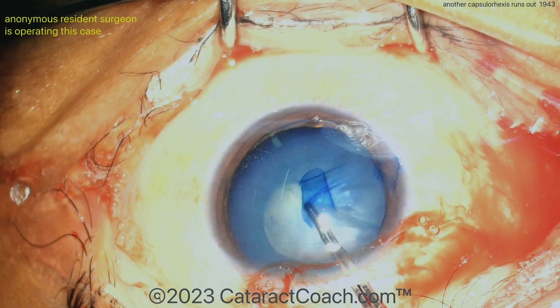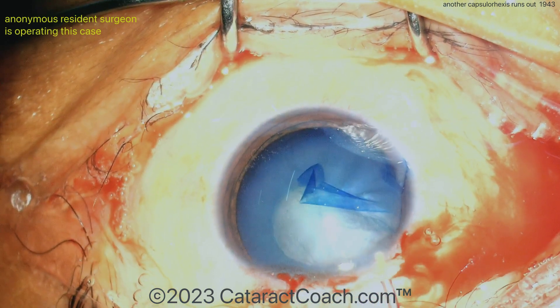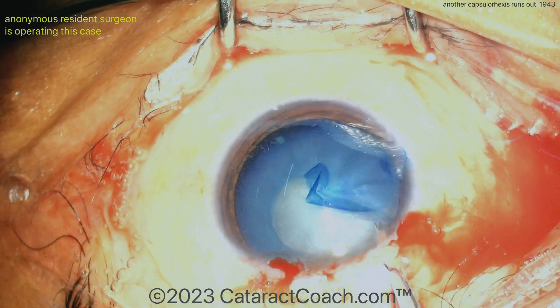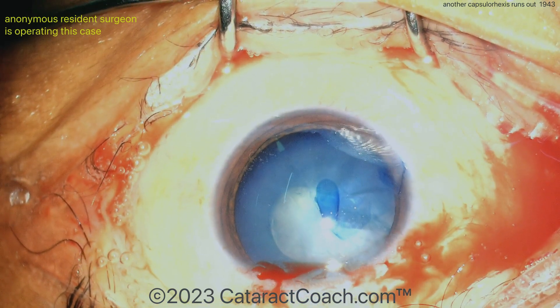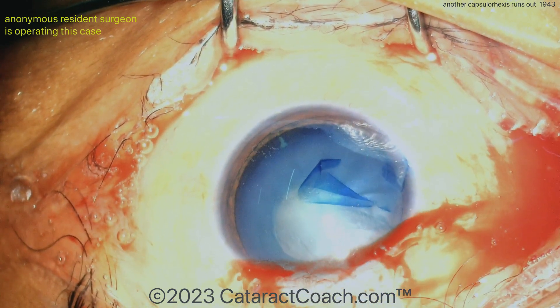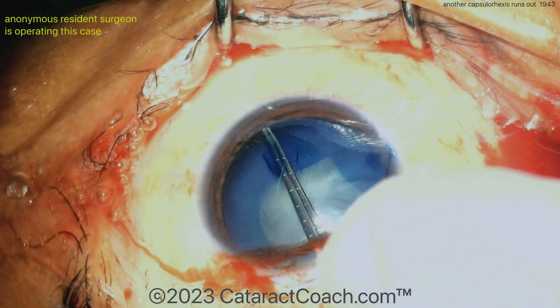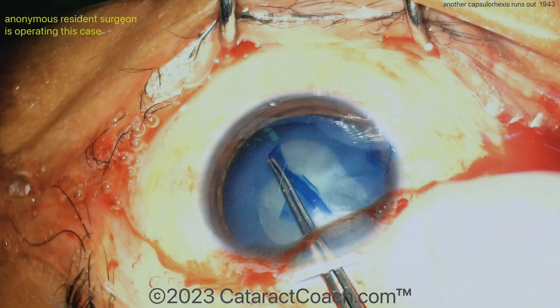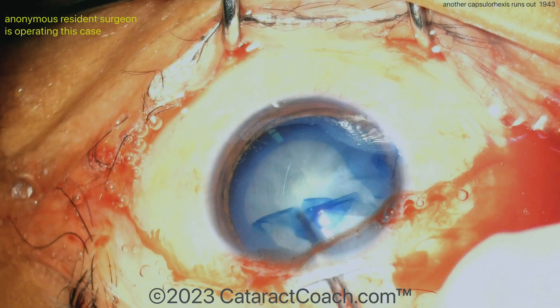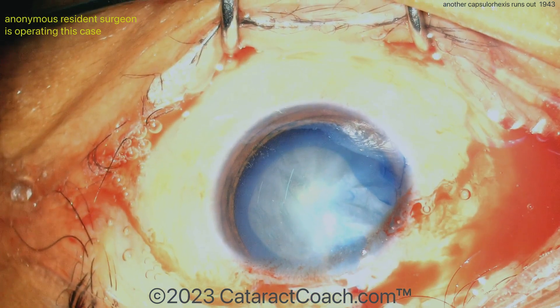So now try to grab the capsule — can you rescue it? Go the other way, maybe perform that little maneuver. Trying. More viscoelastic always helps. There are the scissors — using the scissors to cut the capsule now. And now we can continue, but remember, you have that one area of weakness. Now, fortunately for this patient, the patient will do fine. But the rhexis is a little bit irregular there — luckily it's still sufficiently large to get the nucleus out.